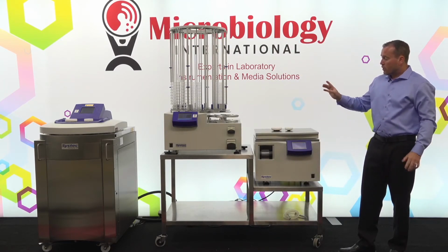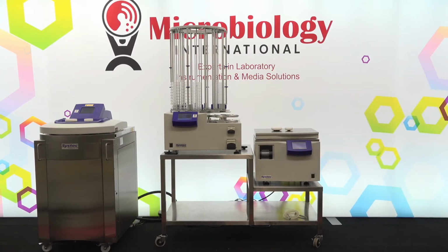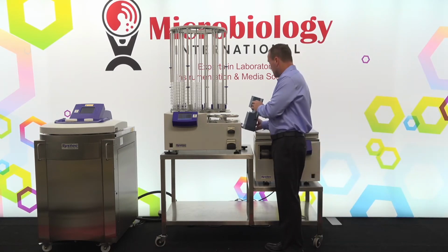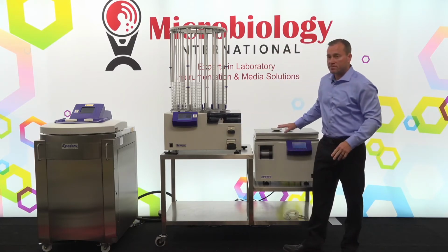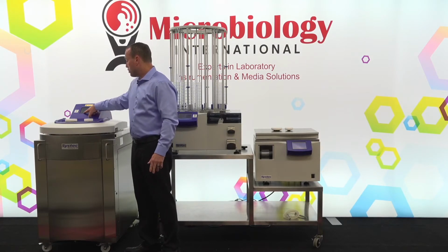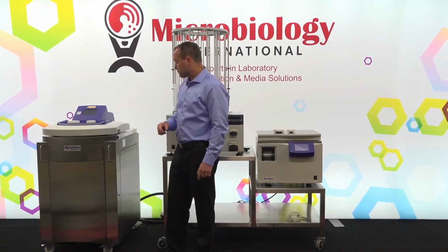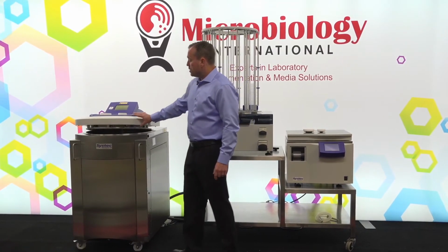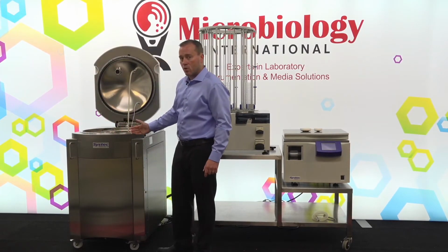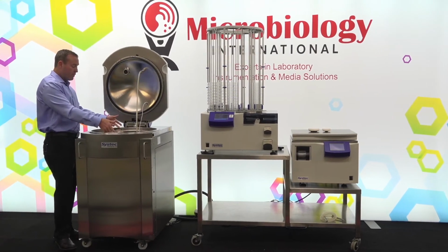So before we would go into any of the other screens that we want to go into for programming, I'd like to go through the MediaPrep 120, just the same sort of look as the MediaPrep 10, except you're going to have a much larger vessel. So the opening is going to be a little bit different. This has a circumference locking ring. So the lid is going to be a little bit different in the fact that it doesn't have any locking pins on the base of the system. The vessel is still removable, so we can remove the vessel from this.